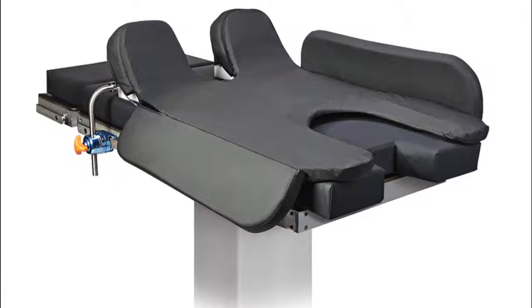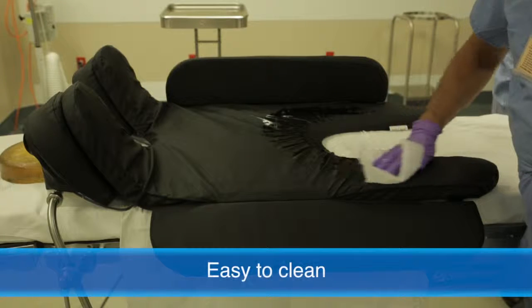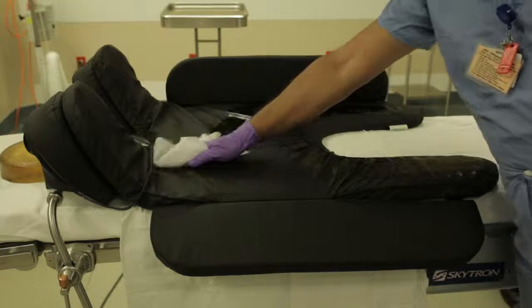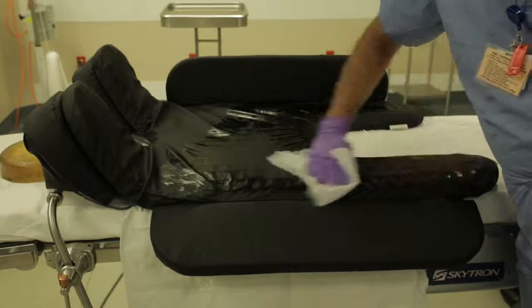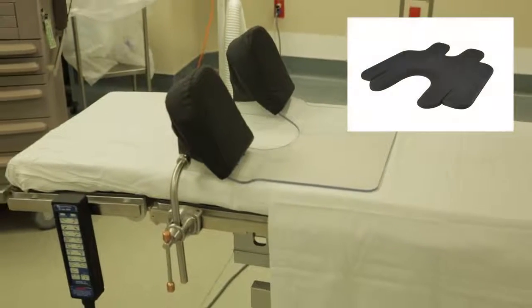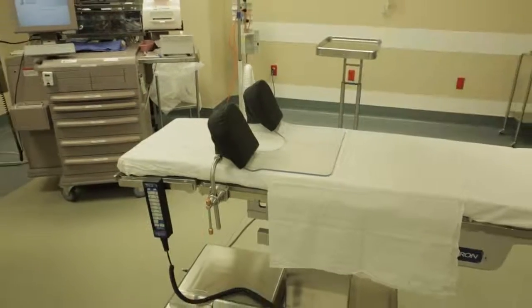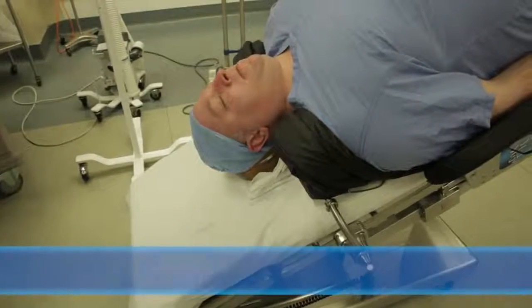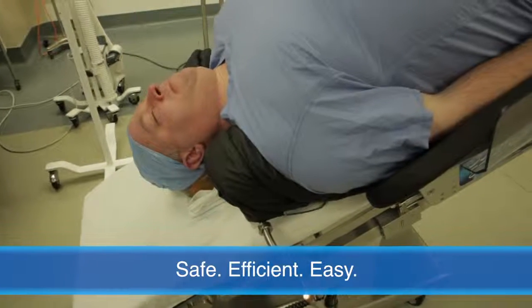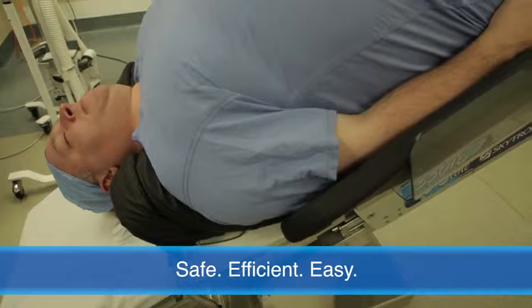The SecureFit TPS is easy to clean. Simply wipe down in the same manner as any surgical surface, using the manufacturer's suggested cleanser. Do not immerse. Before storing, make sure the SecureFit is clean and that the gel pad is flat. The SecureFit TPS Trendelenburg positioning system is an innovative approach to positioning that enhances patient safety and increases OR efficiency.